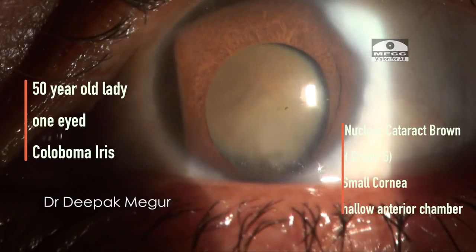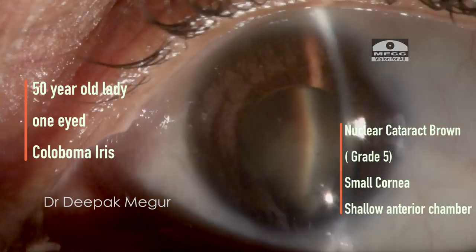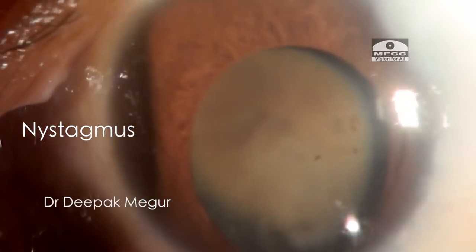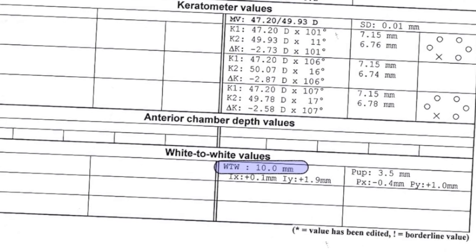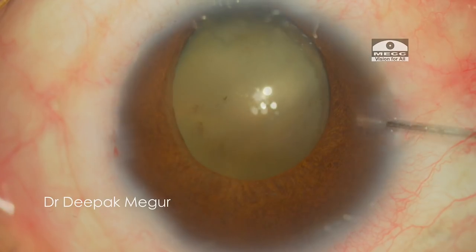Today's case is about a 50-year-old lady. She has coloboma of the iris, a large brown cataract of grade 4 to grade 5. To complicate the situation, the patient also has a small cornea and the anterior chamber is quite shallow. And she is one-eyed.